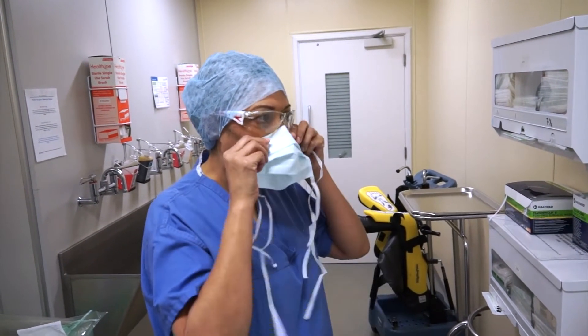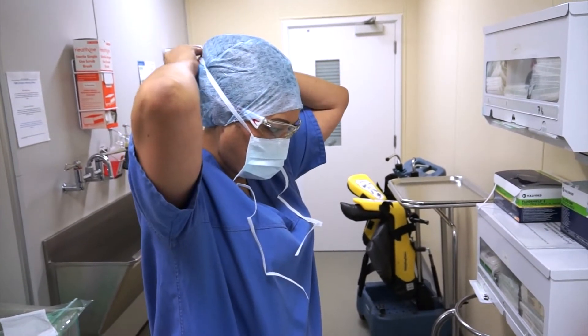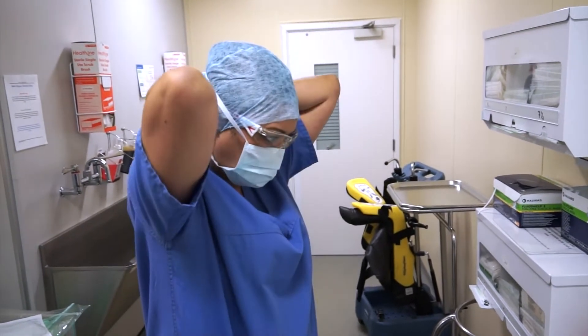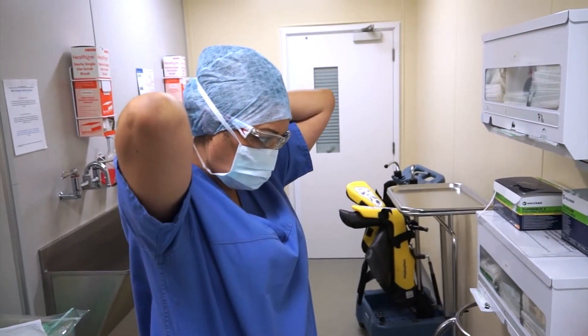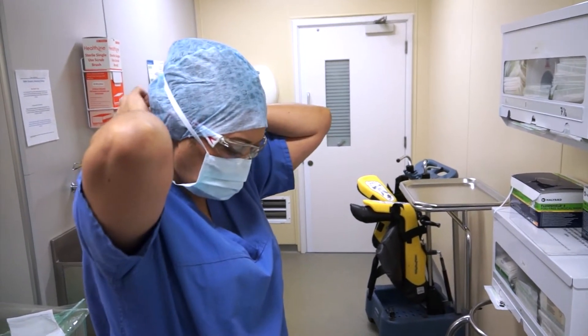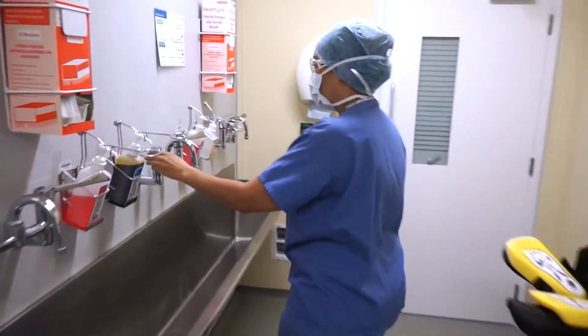I'm putting my mask on, so I've got to make sure that's very comfortable because it might be on there for a few hours. Tie it at the top and then the bottom ties. Some people tie that bottom one on top of the head — whatever's comfortable for you. If you had a beard, you'd need to make sure that was contained within — make sure that's covered. Which obviously these days you don't.